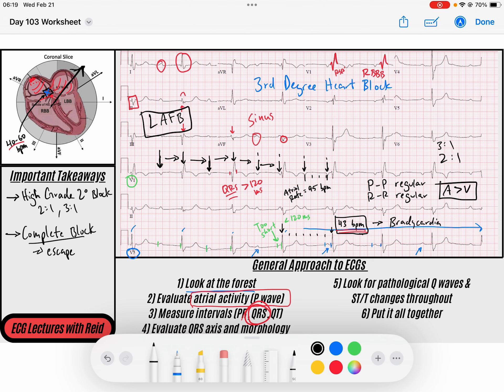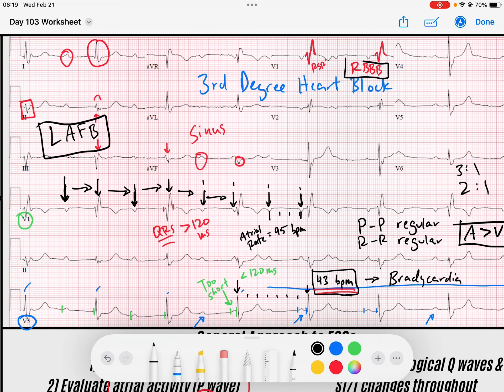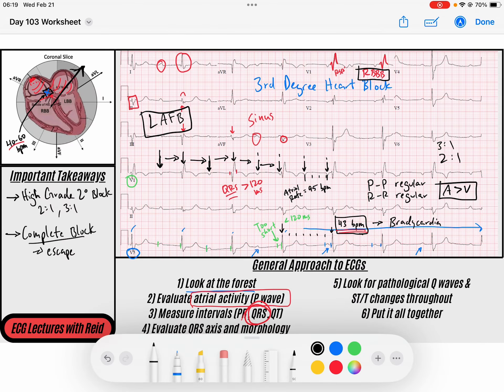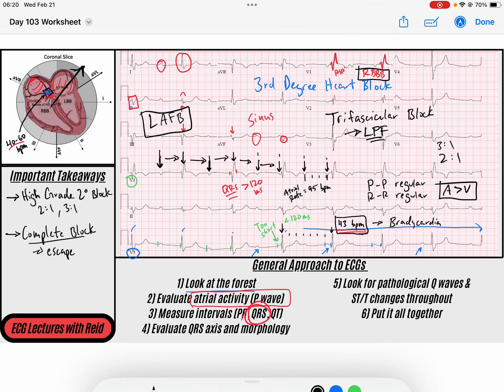This is where things get really cool. This is a complete heart block with an escape rhythm showing the morphology of a right bundle branch block and a left anterior fascicular block - I would call this a true trifascicular block. The escape beat is rising from the left posterior fascicle, which is why it gives that morphology. The right bundle branch is blocked, plus both fascicles of the left bundle - the left anterior and left posterior - are involved. We're getting an escape rhythm coming off distal to the block of the left posterior fascicle. If you don't understand these concepts, don't worry - it's a hard concept, and luckily the treatment doesn't really change regardless.